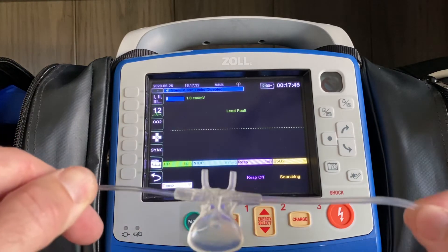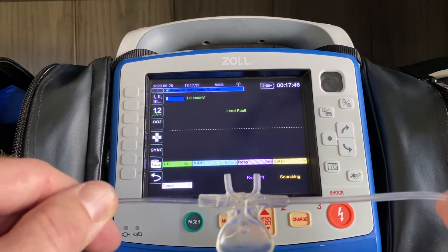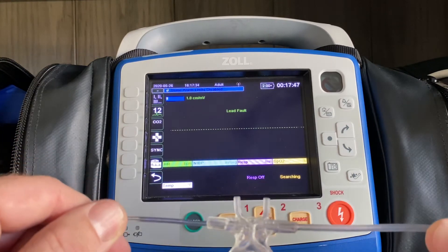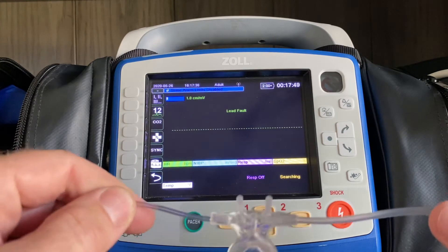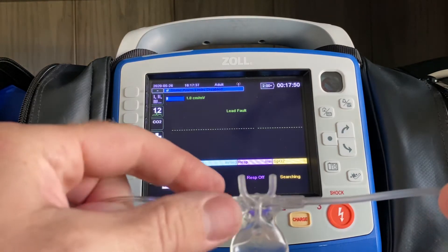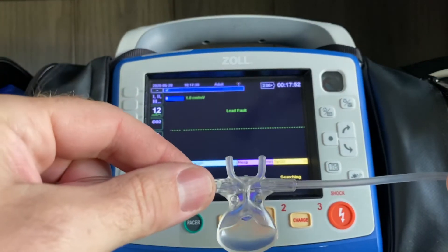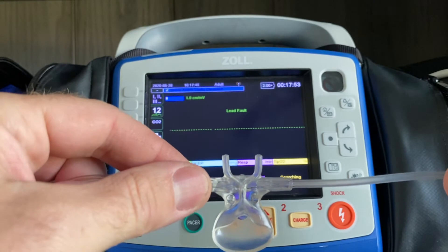The way this disposable piece is set up allows for a heavy mouth breather or nose breather to have the values recorded either way.